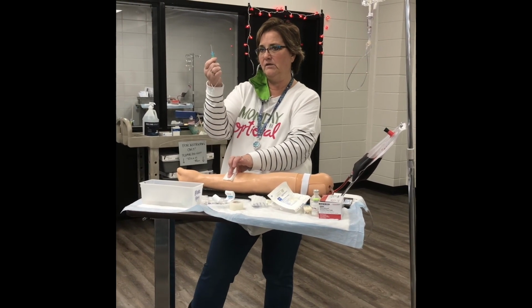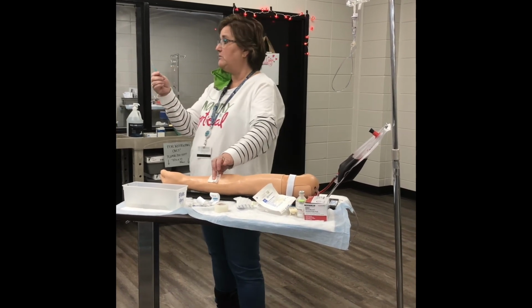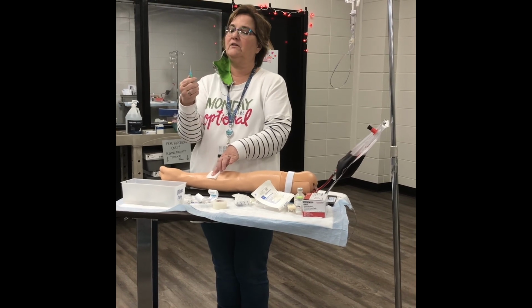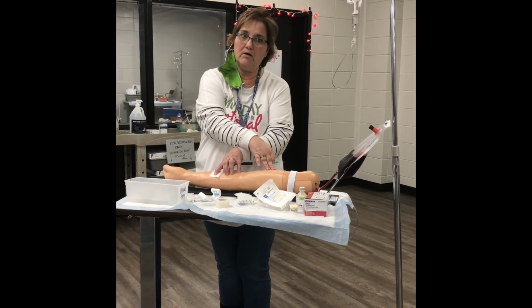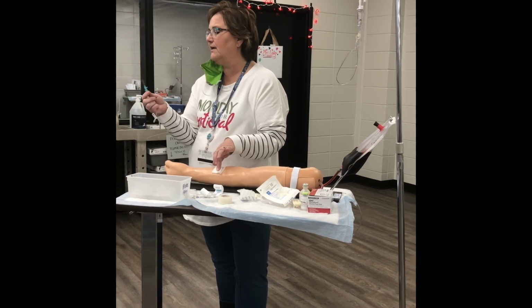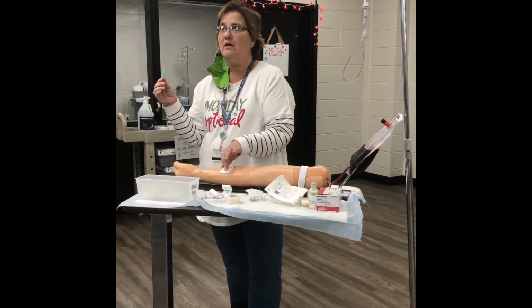What am I looking for? If it's broken, does it look like it's supposed to be an inch? And this does. Is it frayed at the end? Does it look like it's got a piece missing? If it does, that's an emergency, right? So tourniquet goes on the arm and you call for help. Don't leave your patient. You got to get an x-ray. They show up on x-ray, so hopefully it's still in the arm and they can go get it out.